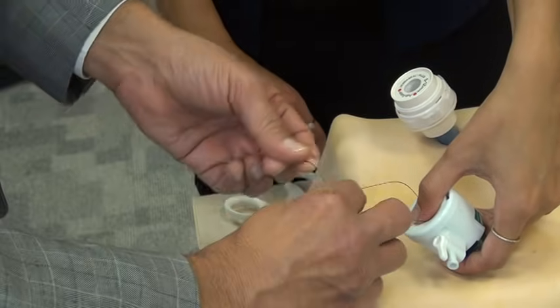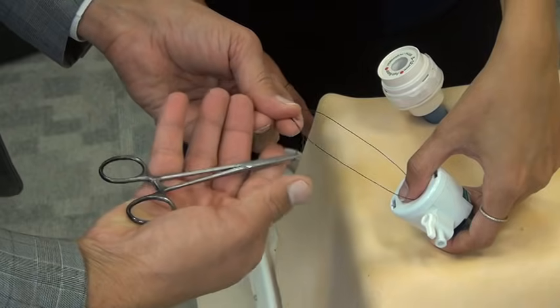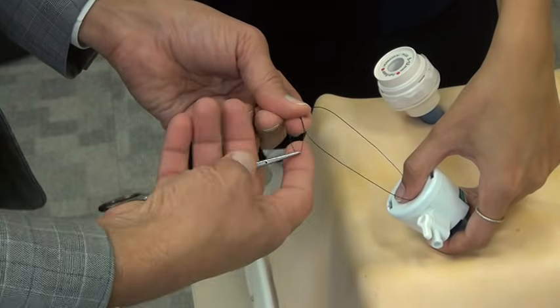We'll tie a first square knot, holding the clip in your hand so you know this is the needle end.